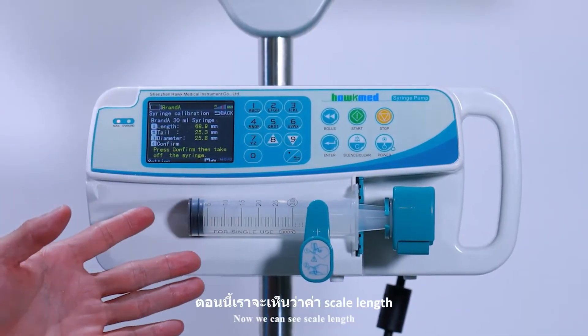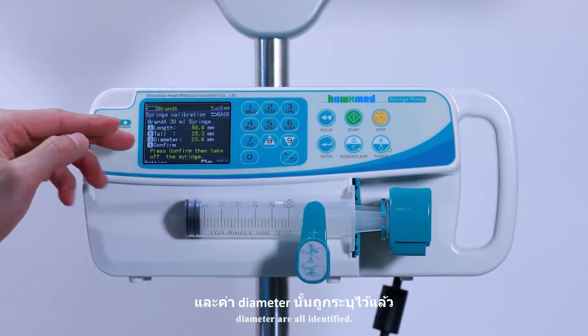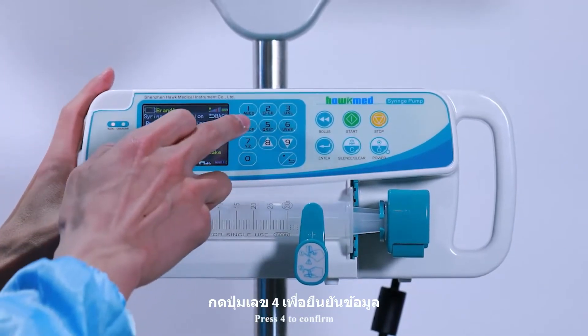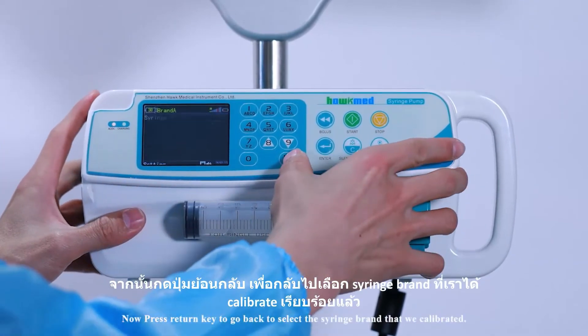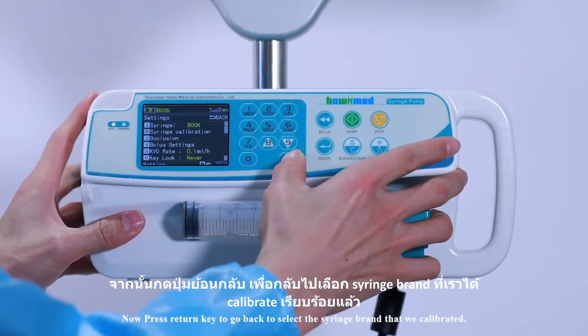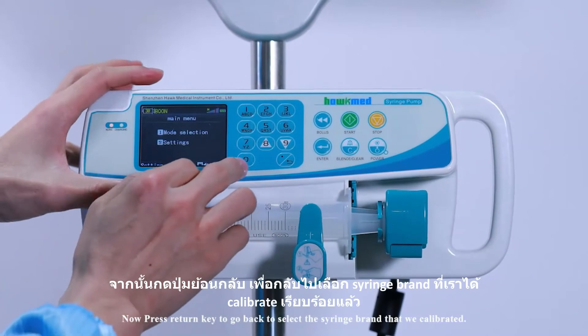Now the scale length, tail length, and diameter are all identified. Press 4 to confirm. Then press the return key to go back and select the syringe brand that was just calibrated.